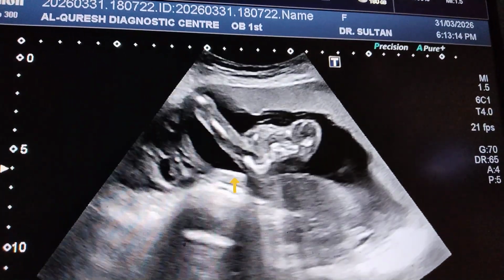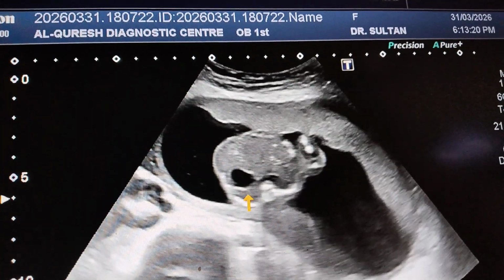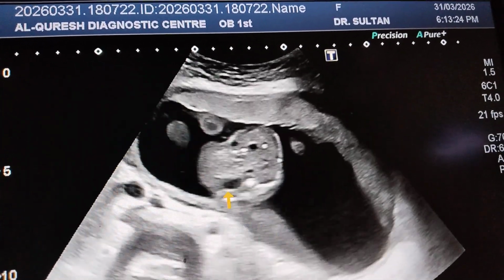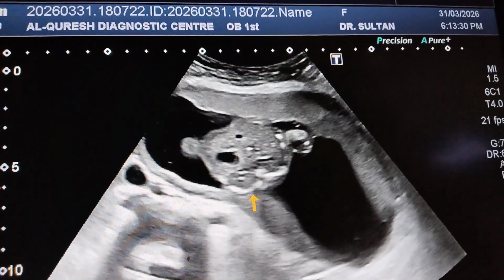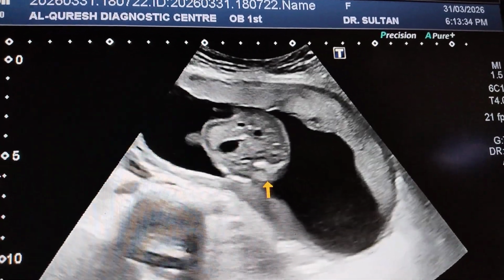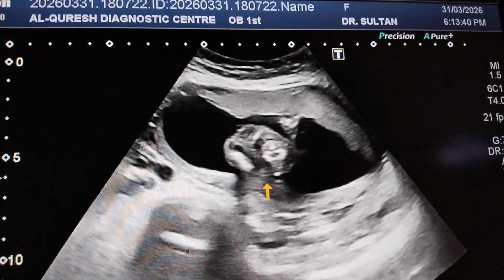And what are the differentials of this lesion? So it may be meningocele, or anterior meningocele. So let's see if these lesions are present like meningomyelocele and meningocele, and there should be a defect at that region within the spine.